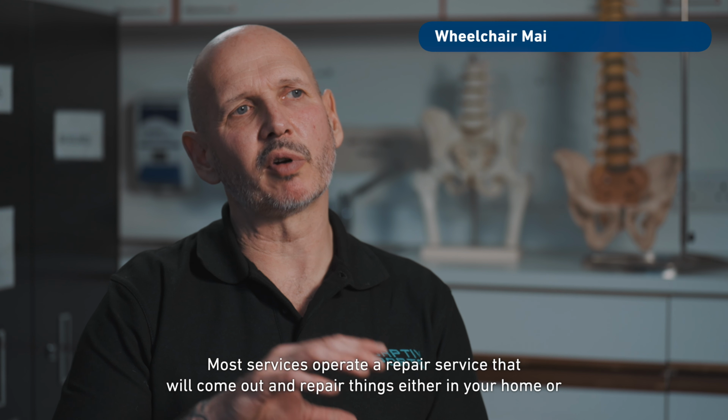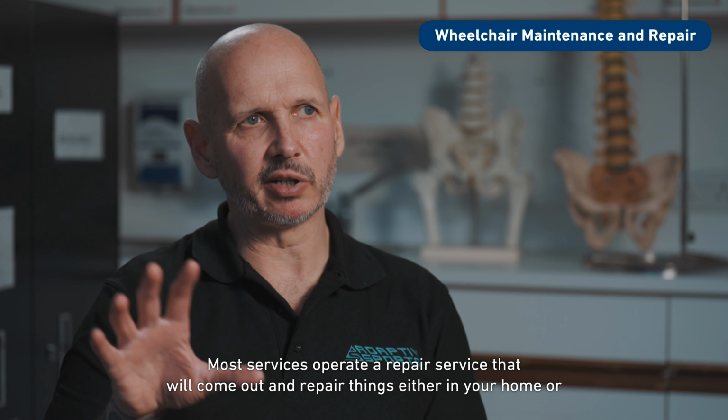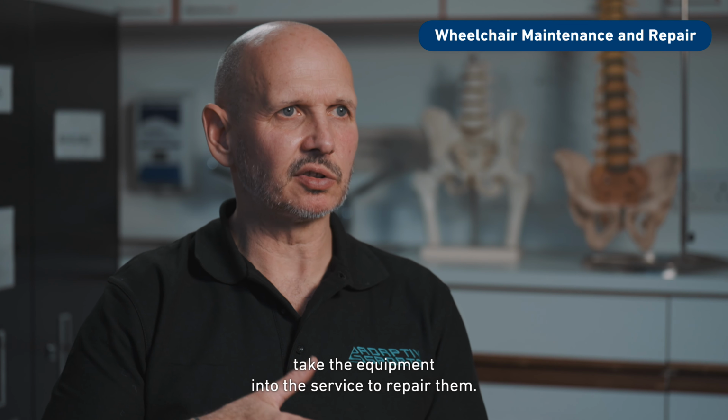Most services operate a repair service that will come out and repair things either in your home or take the equipment into the service to repair them.